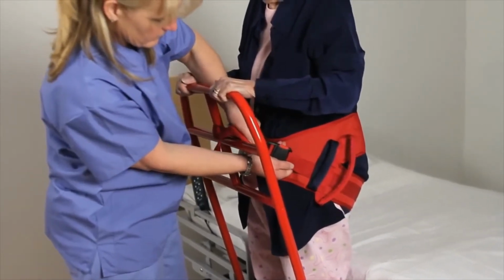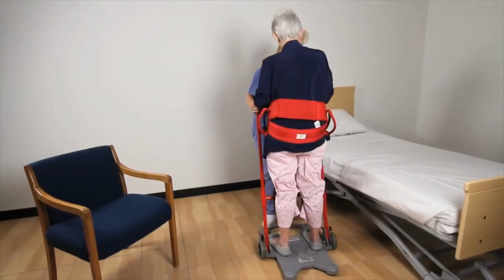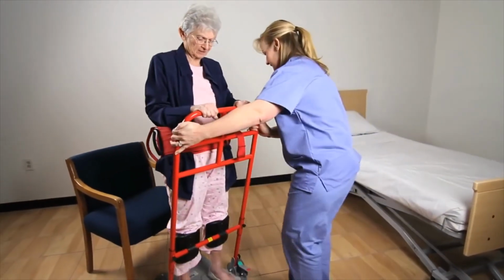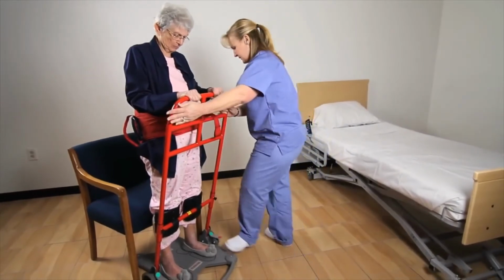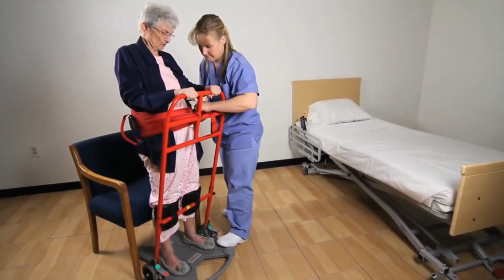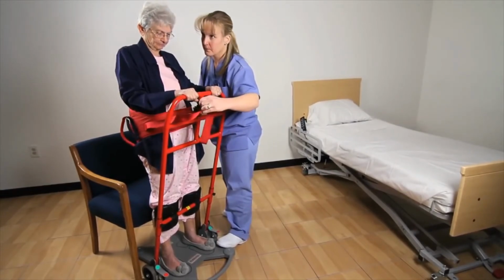Now, move the patient to the desired seating position. Hard floor or short, soft carpets will work best. When you help a patient to the toilet or commode, move as close as possible and then apply the brakes. Now, the patient can undress themselves, or you may assist them as needed.